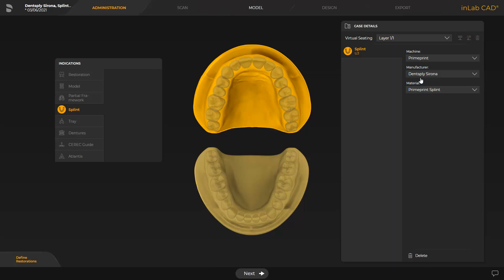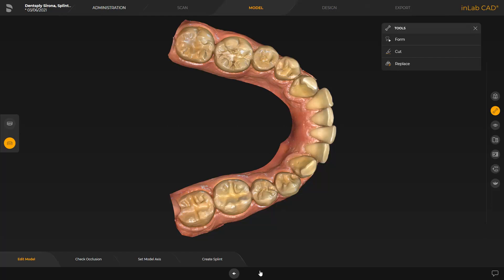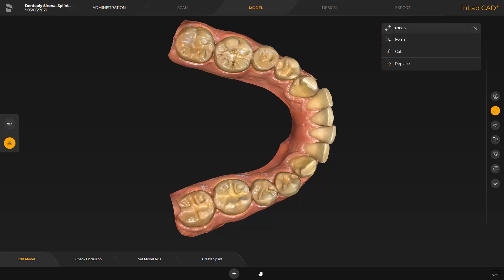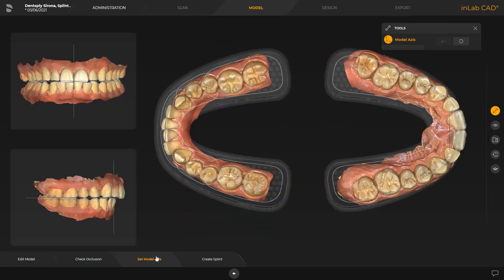Since we are working with intraoral scan data, this phase is grayed out and we proceed directly with the model phase. The InLab software guides us to the step Edit Model. With the different tools, we could edit the model data if desired. In our case, we continue with the Set Model Axis step. The model axis is automatically suggested by the software. If needed, it can be redefined in the three different views. This alignment is required to calculate optimal initial suggestions. Finally, we tap on the last step, Create Splint.